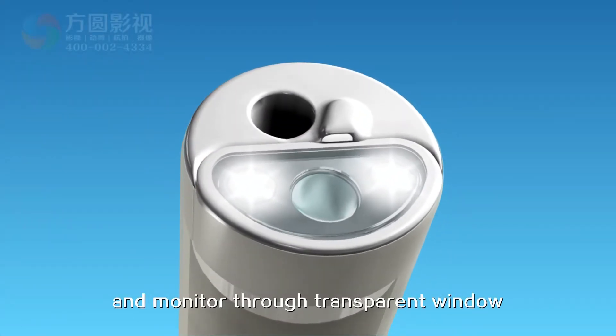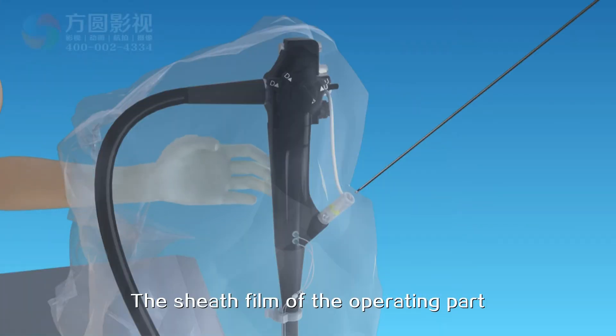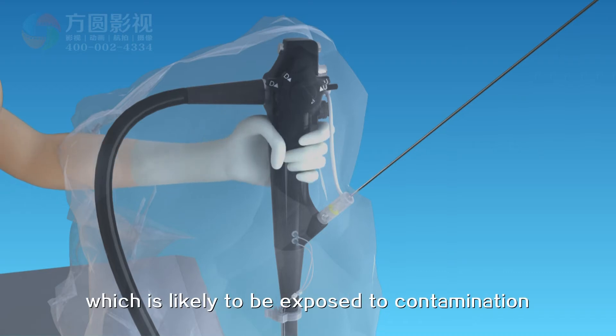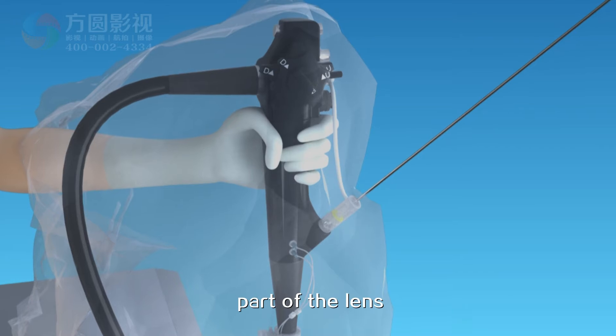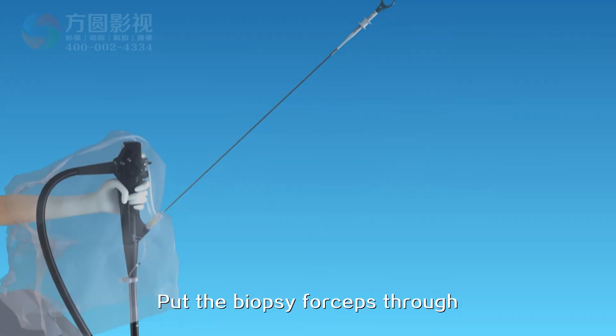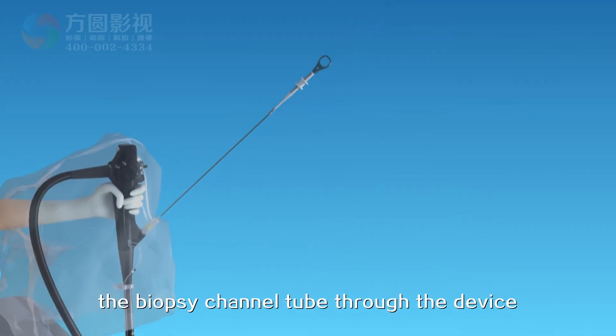The sheath film of the operating part can prevent the right hand, which is likely to be exposed to contamination, from contaminating the left hand and the operating part of the lens.